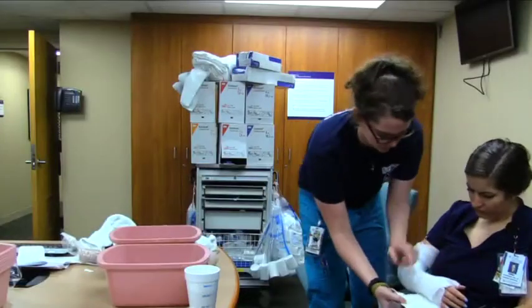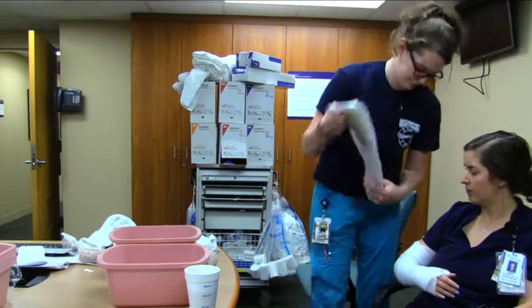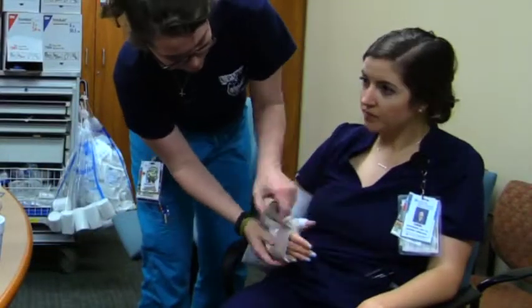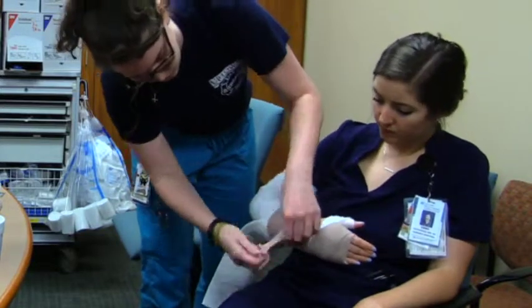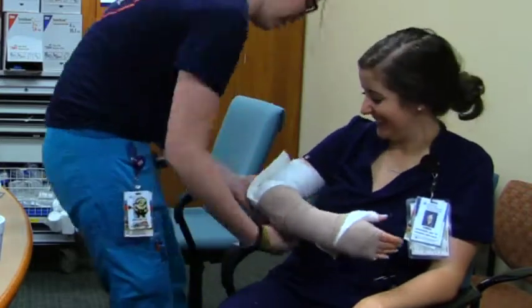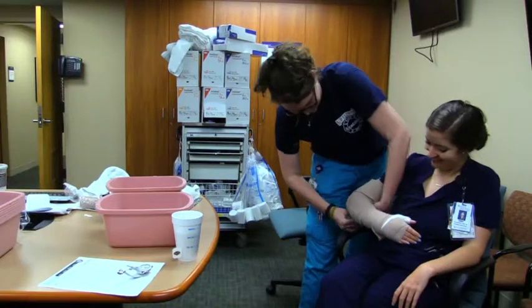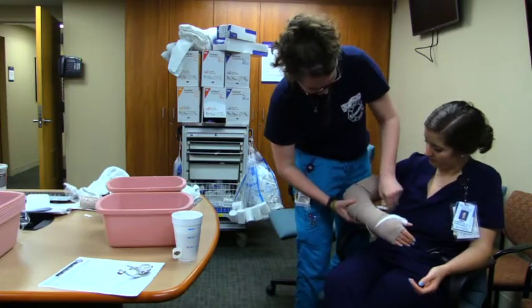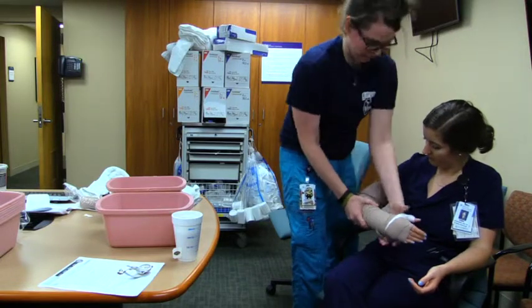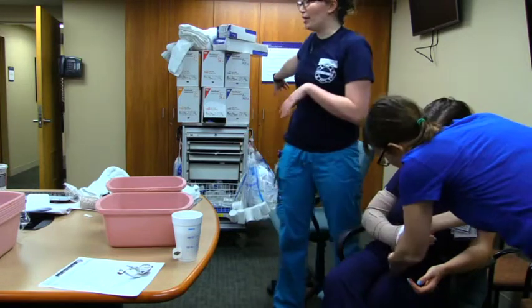The colored side — the yellow side to the skin? This side. So, this one's really not that pretty, guys, but this is how it's going to look. So you usually use two ace wraps total? I usually use more than two ace wraps, but we've got a limited number of supplies.